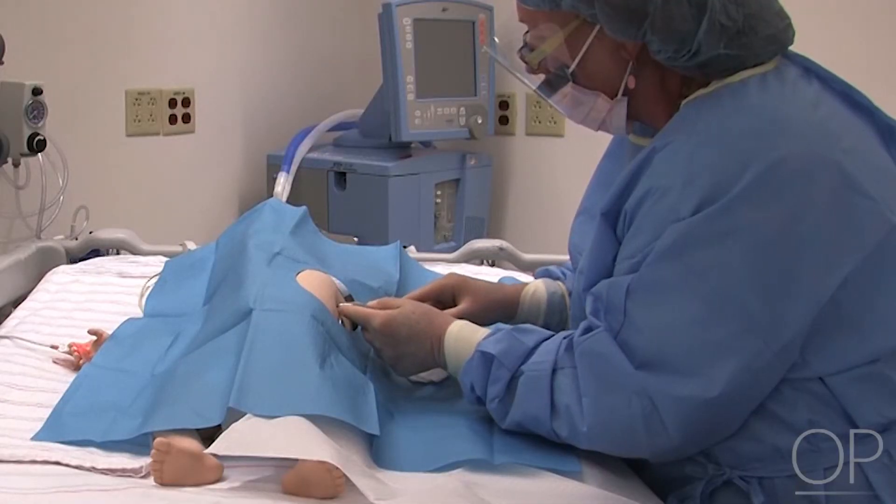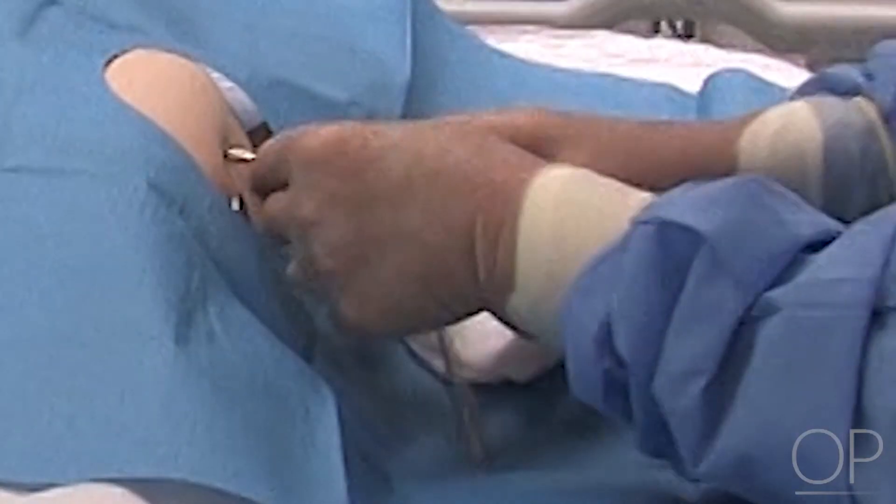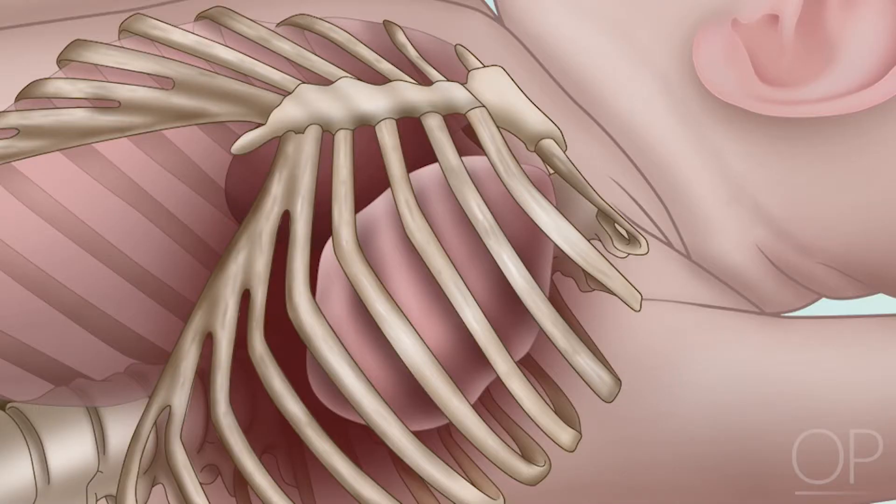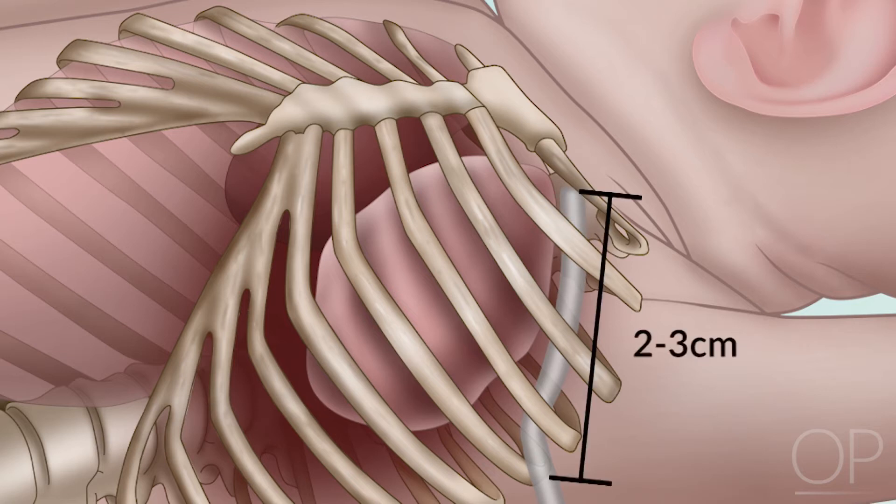To ensure the chest tube is directed anteriorly, be sure to drop your wrist while advancing the chest tube into the patient. Direct the tube anteriorly to the apex of the thorax, to the predetermined length, assuring all side holes are inside the chest. This distance is approximately 2 to 3 centimeters for infants less than 1,500 grams, and approximately 3 to 4 centimeters for infants greater than or equal to 1,500 grams.